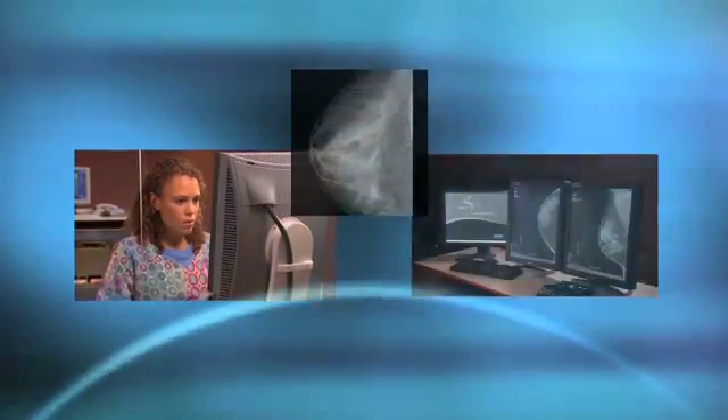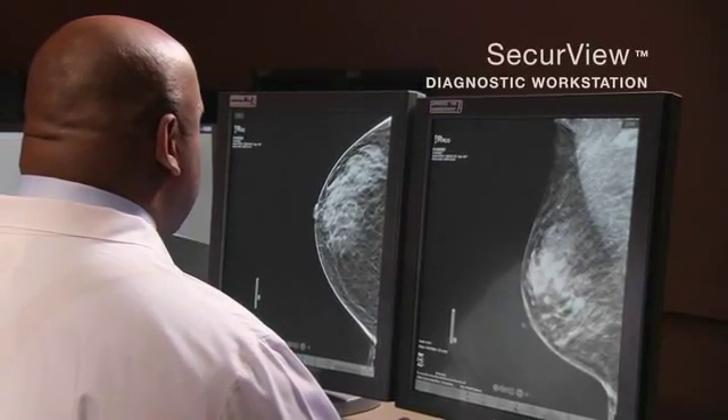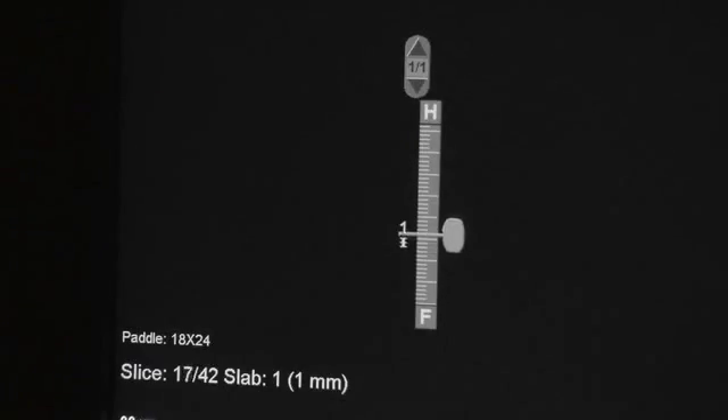Once the exam is finished, she can forward the study digitally to the radiologist, who may be across the hall or across the country. The radiologist can examine both 2D and 3D studies with an upgraded SecureView diagnostic workstation.